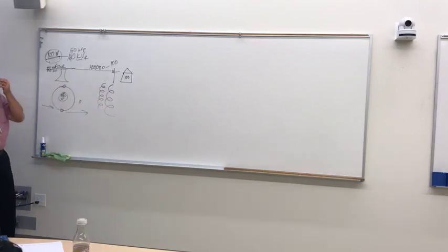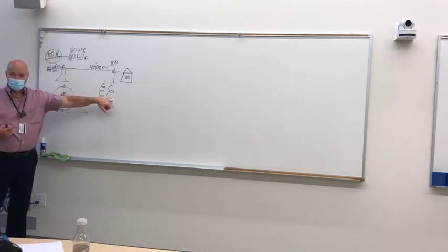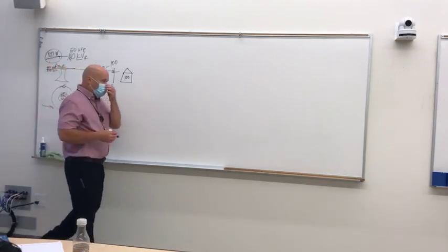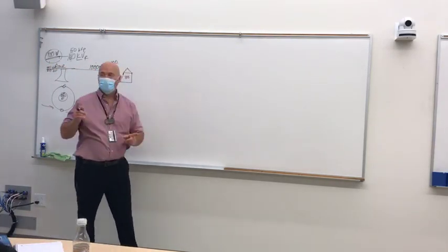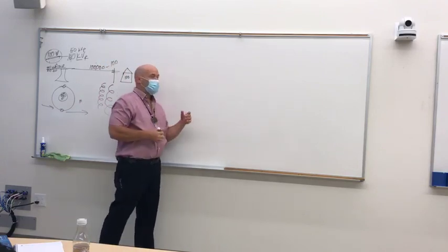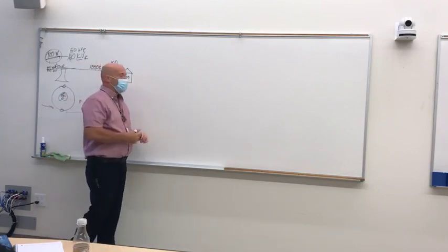So what we can say is that this coil of wire has more turns on it than this one, okay? So what we're talking about is a turns ratio. Turns ratio inside of a transformer is what makes the transformer work. And for those who are not here today, this is just a course overview, so this is not on the first test.